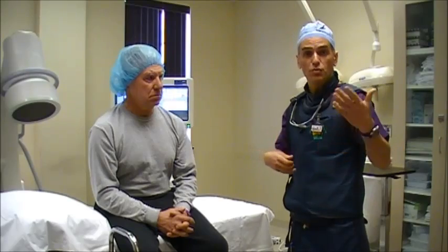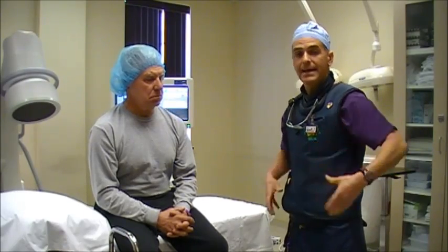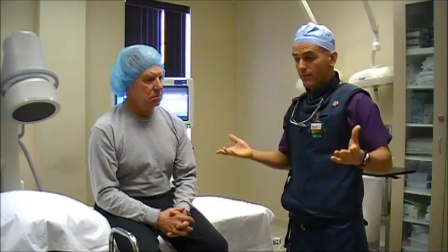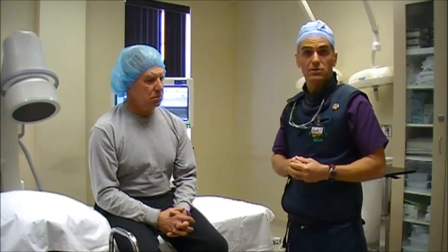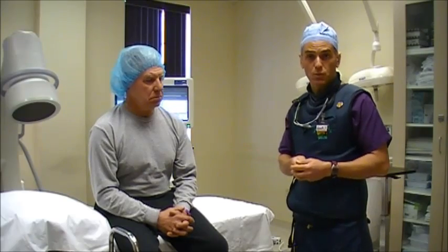Unfortunately, these nerves do regrow, they do regenerate, and 14 months later the nerve has grown back and the pain has returned. However, it's a fairly simple procedure, as you'll see, and to get about a year or more relief from a very quick procedure is well worth it.